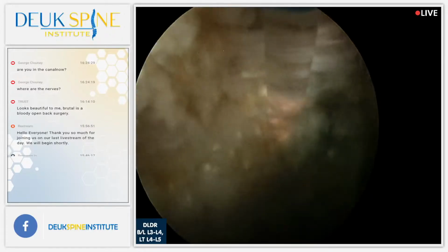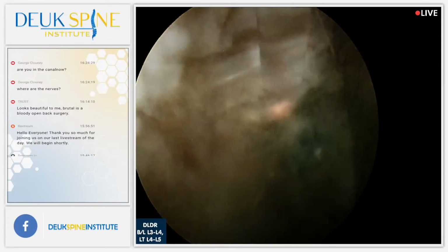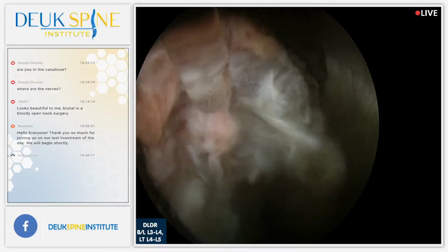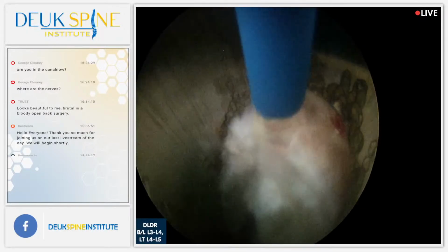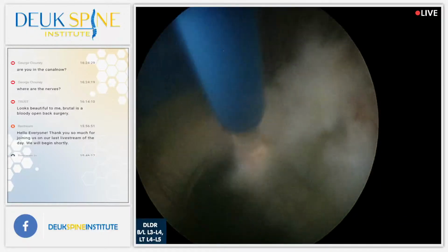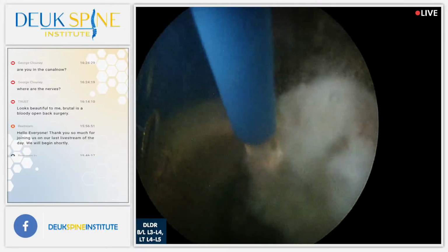I think she's going to do fantastic. Going to feel a lot better. Look how calcified it is. That's not normal. That orange golden stuff is calcium deposits. It's abnormal bone spurs forming. Right there. It's all herniation. This is lateral in the foramen.